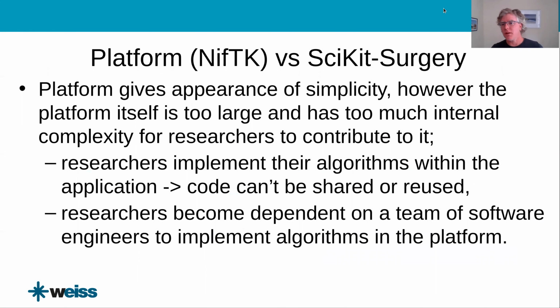And the reason we've done this is because whilst NiftyK gives the appearance of simplicity, the platform itself is so large and has such internal complexity that we find that we can't get researchers to contribute to it. And this leads to two things. One, researchers start implementing their algorithms within the application.